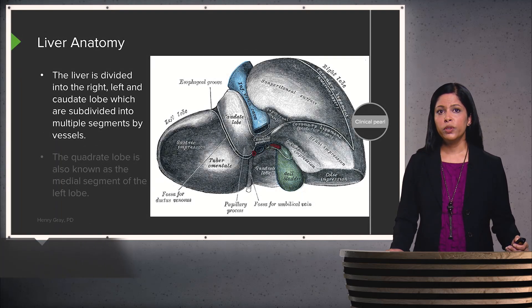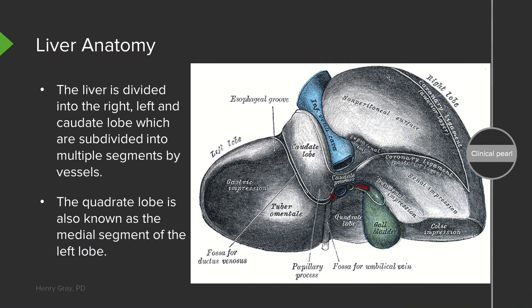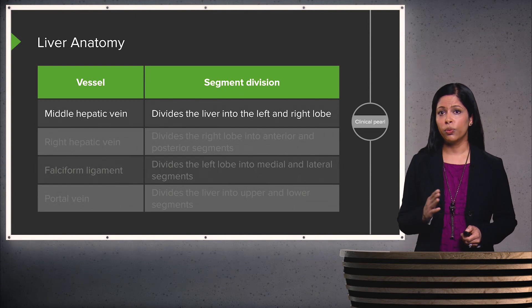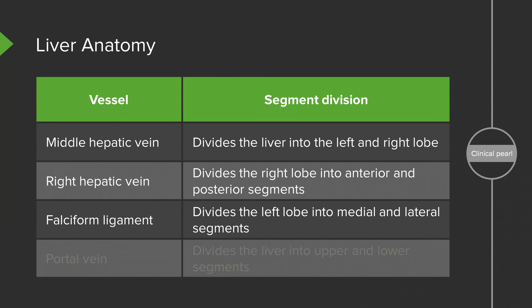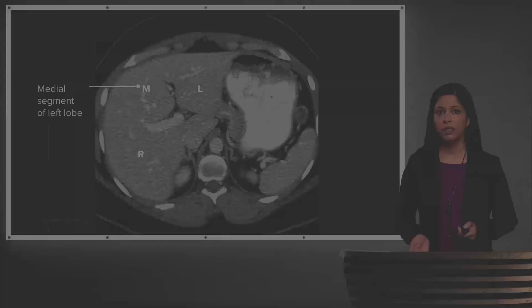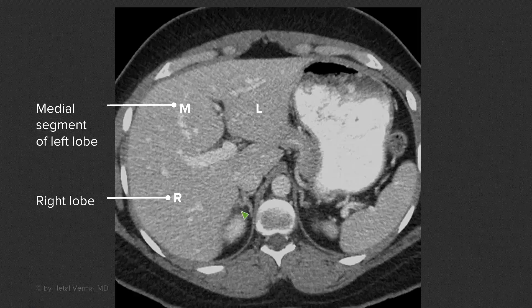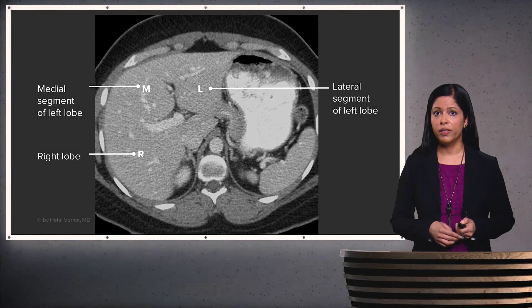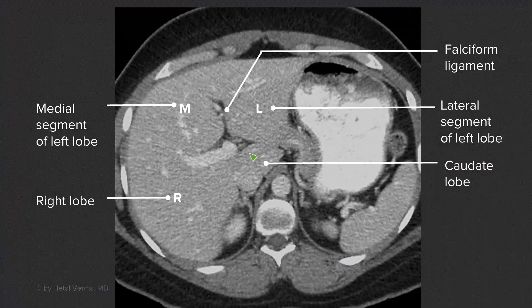The liver is divided into right, left, and caudate lobes, which are then subdivided into multiple segments by the vessels. The quadrate lobe is now known as the medial segment of the left lobe. The middle hepatic vein divides the liver into right and left lobes. The right hepatic vein divides the right lobe into its anterior and posterior segments. The falciform ligament divides the left lobe into its medial and lateral segments. The portal vein divides the liver into upper and lower segments. Down here we see the caudate lobe.